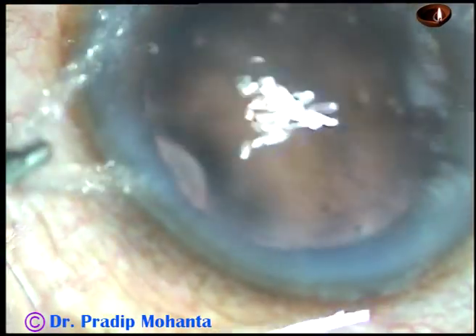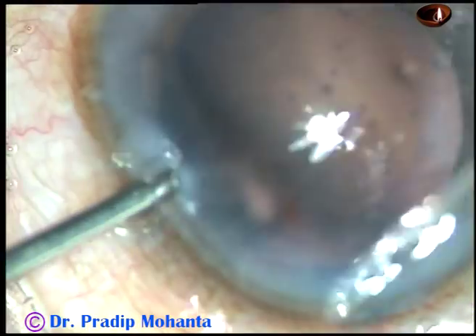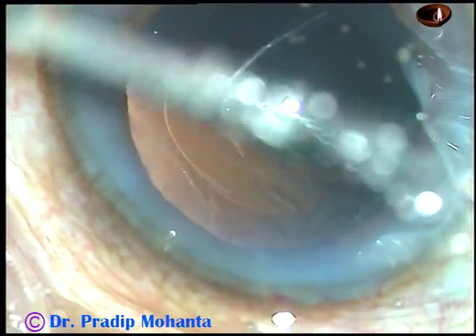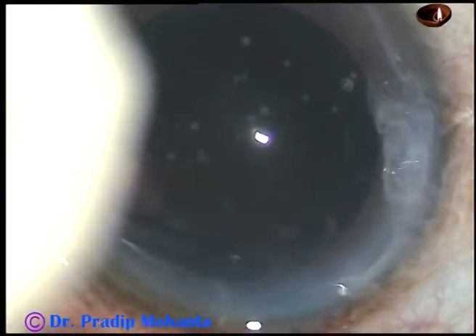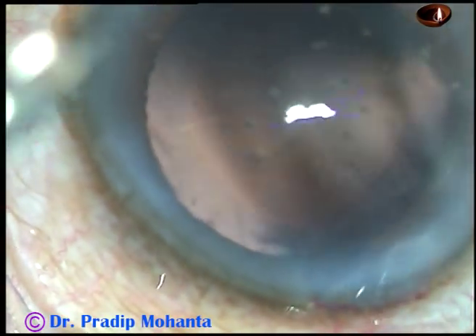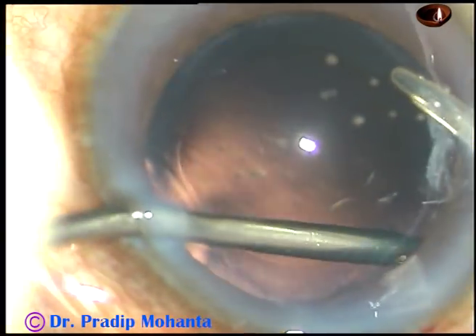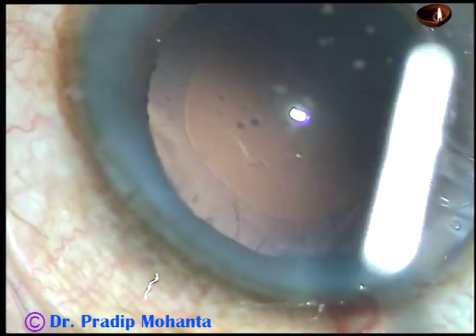Cortical cleanup is done very nicely. You can see there are some cells sticking to the posterior capsule in the sub-incisional area. I am in I/A 2 mode and trying to remove this, but the sub-incisional cells need to be hydrated and dislodged. So I use only irrigation to dislodge it, then go again with the aspiration port. In I/A 2 mode the vacuum is only 40 mmHg and flow rate is 20. The capsule has been nicely polished.